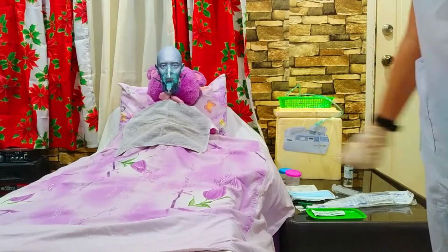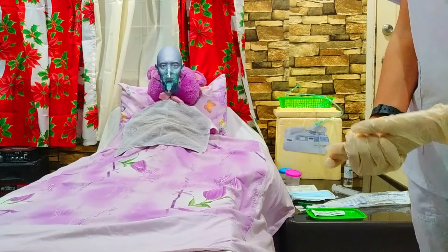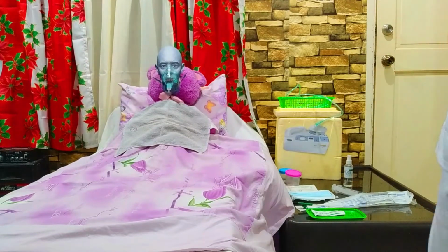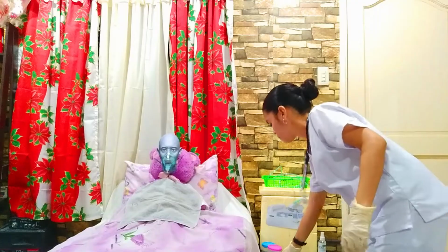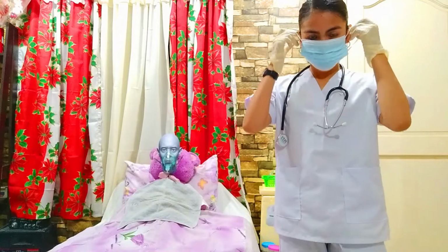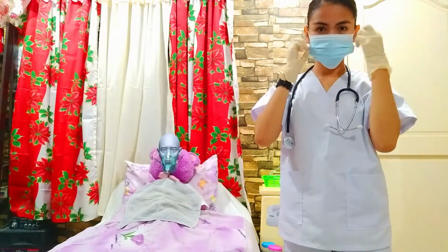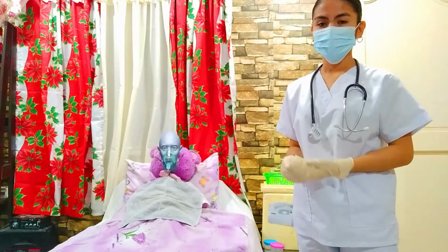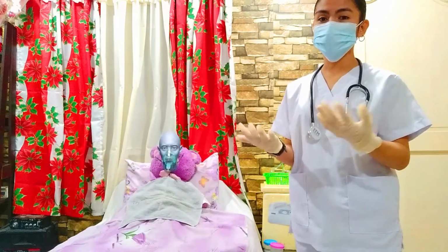The next is we need to don additional PPE, or put on a face shield or goggles or face mask. And then we need to don sterile gloves.